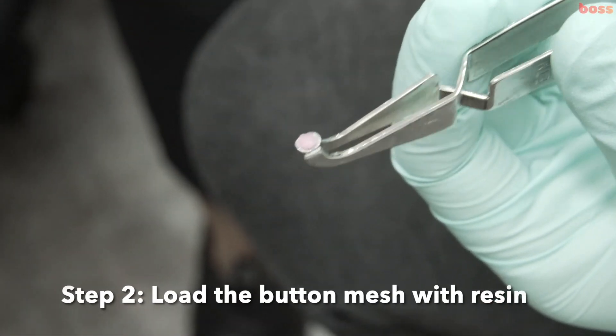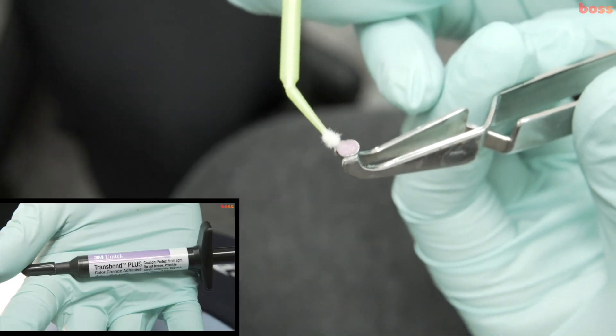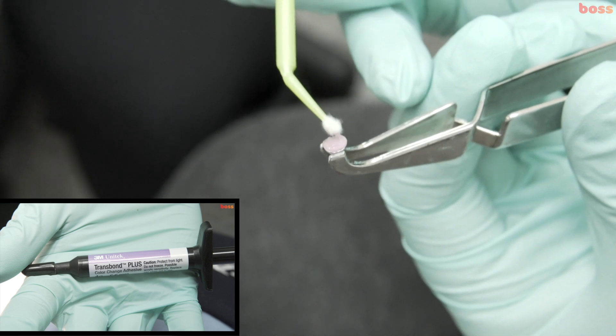You want to cover the entire base of the button with composite. Sometimes you can dab a tiny bit of bond, but please don't make it too liquidy.